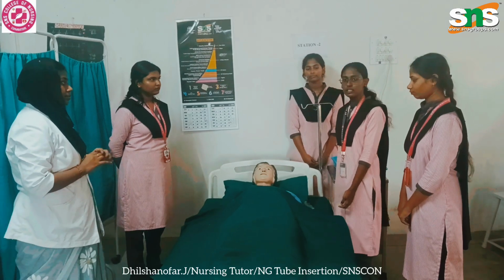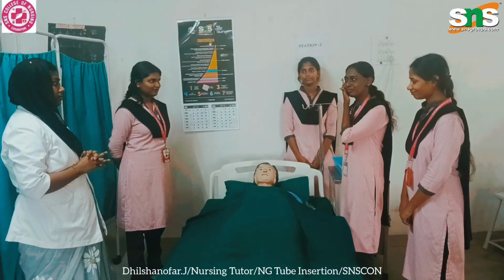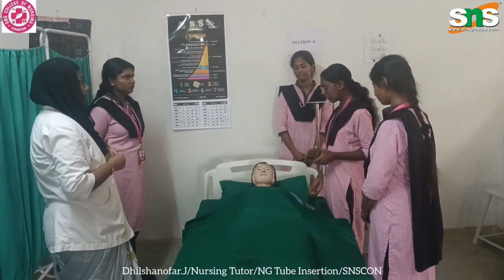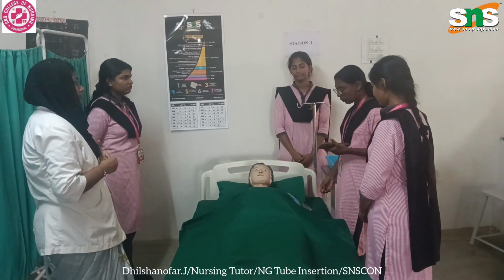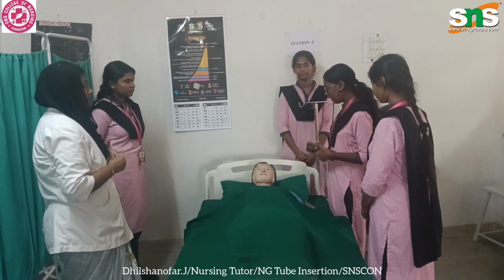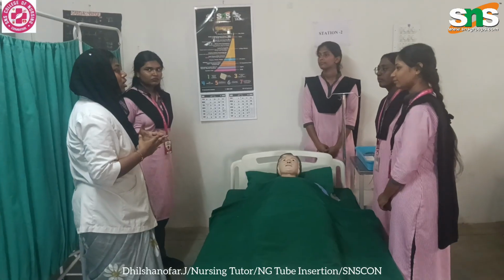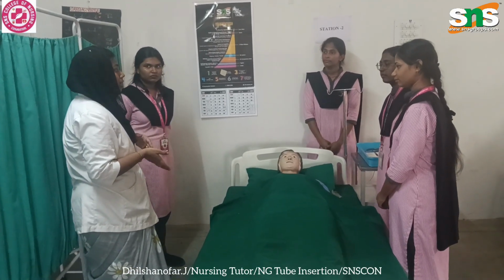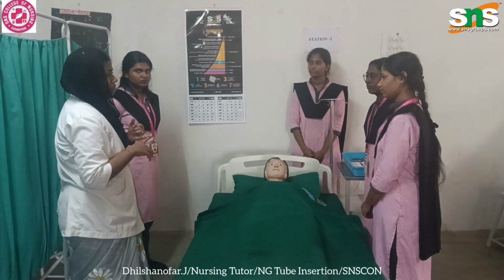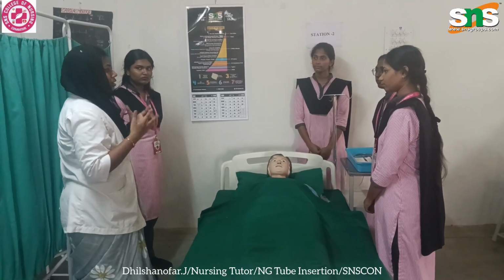What are the indications and purposes? Indications are for unconscious patients and patients who cannot take oral intake. To feed a client with fluid when oral intake is not possible, to dilute and remove consumed poison, to instill ice cold solution, to control gastric bleeding, to relieve vomiting and distension. We also give it to patients who have undergone surgery. Immediately after the surgery they can't swallow food. The ultimate goal is to provide food and medication to the patient who cannot take orally.